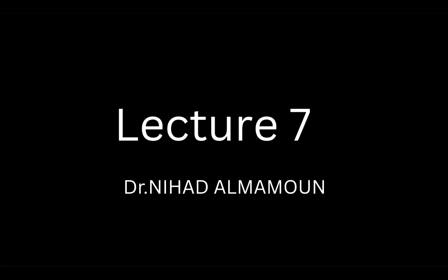On today's session, abnormal calcification of the abdominal X-ray. Understanding these calcifications is crucial for accurate diagnosis and patient management. Throughout this lecture, we will explore the different types of calcifications, their clinical significance, and how to differentiate them on imaging. Let's dive in and enhance our understanding of this important topic.